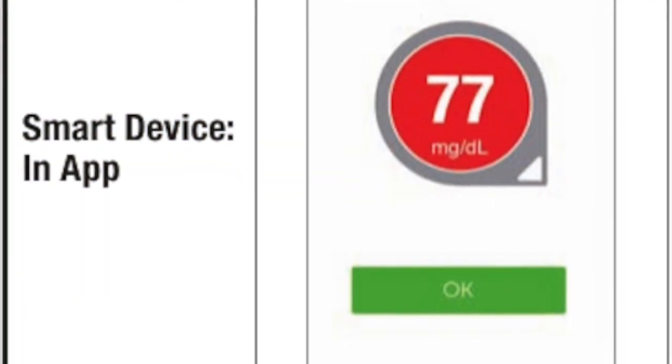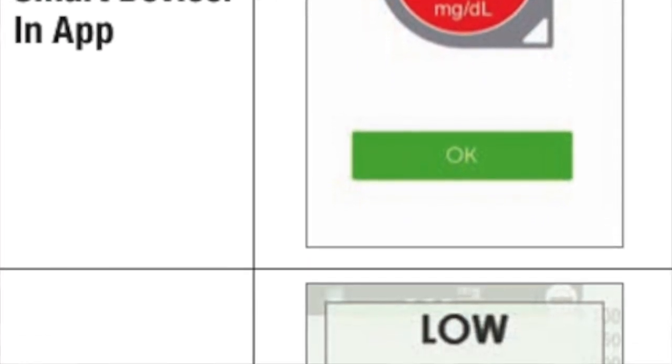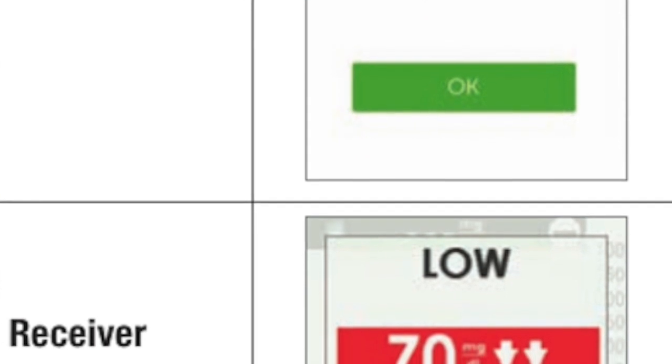Do you feel your lows now, do you think? Yeah. When he's awake. Yes. I wish there was the opportunity of having it at 70 during the day and 80 during the night. But if it gets to 70 or below, it will make an alarm, and then we would just treat accordingly. And then have the down arrows. The fall rate scheduled also. So fall rate at what level? Well, they have it 2 milligram or 3 milligram. Because I hear some sports coming in, you might want to do 2 milligram per deciliter per minute or something like that. It's either 2 or 3 are your choices.